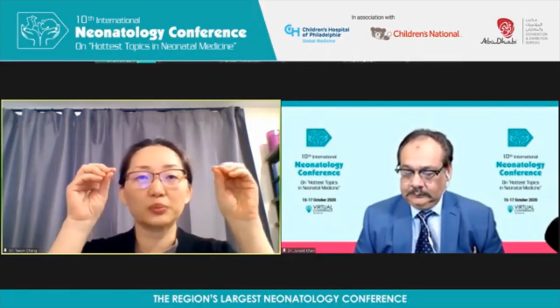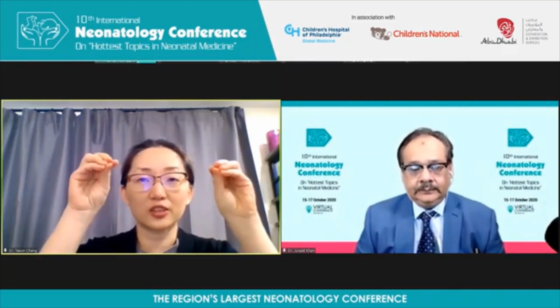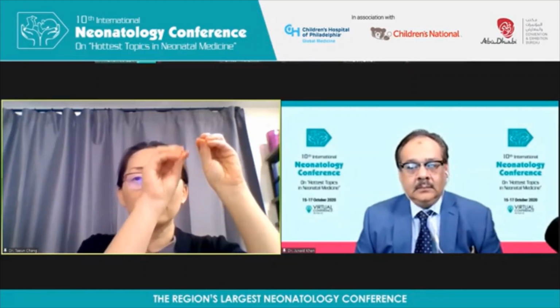So again, with EEG or aEEG, the electrographic activity changes so much, because initially these are just neurons that are not connected, not talking to each other on the cortical surface. And not only that, the neurons in the thalamus and basal ganglia are not yet connected to the cortex, so you don't get sleep-wake cycling.